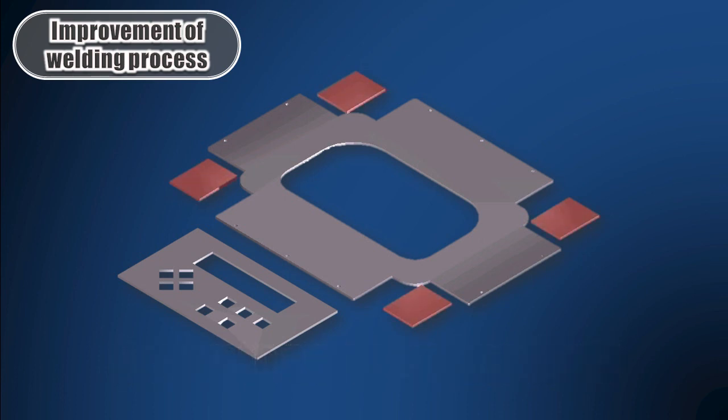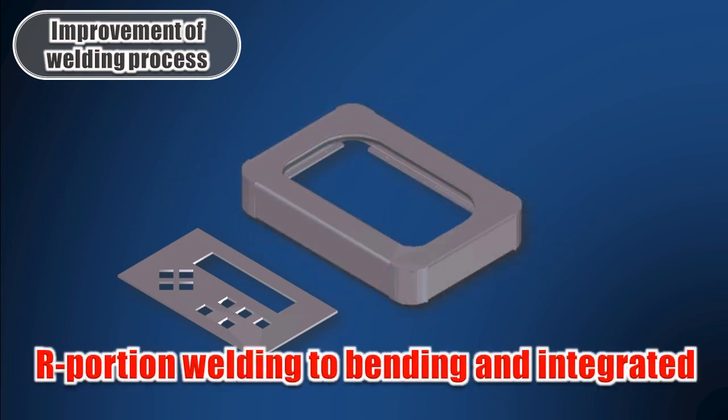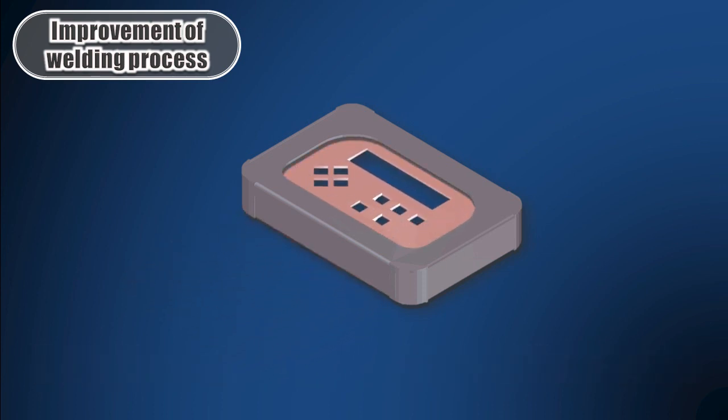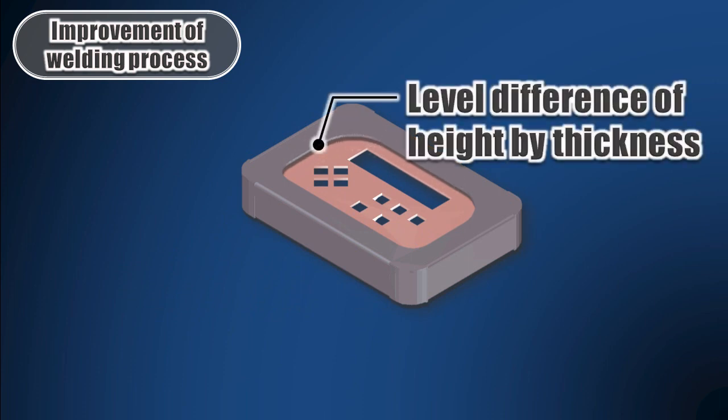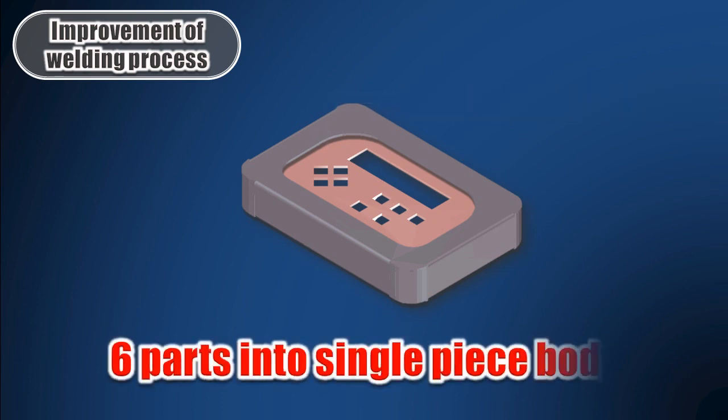First, the corner parts with the radius are combined with the sides, and the R shape will be changed to a bending process. The front section has a difference in level of about the material thickness for mounting the panel. Until now, these parts were welded together. We eliminated the welding by changing to endless Z-bend during the blanking process. Now, those 6 parts become one single piece body.